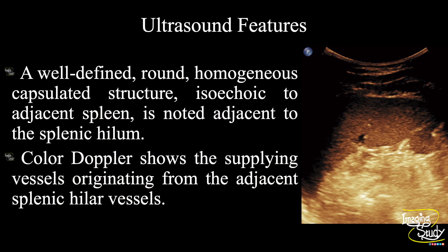So in summary, a well-defined round homogenous capsulated structure isoechoic to the adjacent splenic parenchyma is noted adjacent to the splenic hilum. Color Doppler shows the supplying vessels are originated from the splenic hilar vessels. These features are consistent with a splenunculus or accessory spleen.